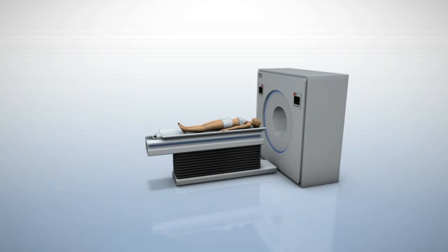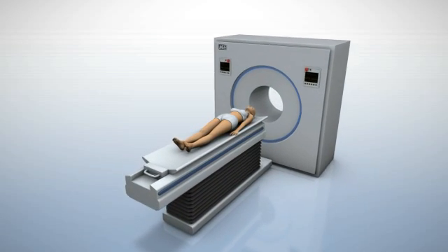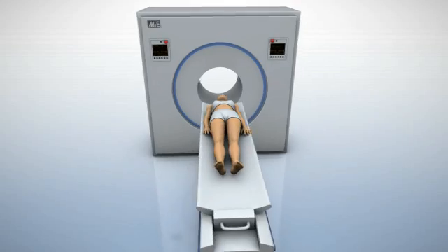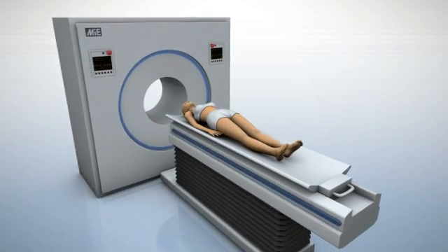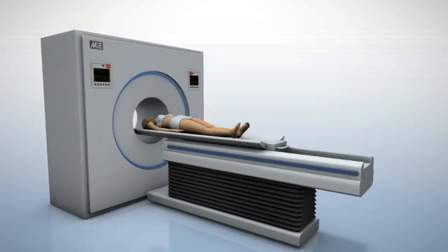The ECAT SYNTRON PET system from MIE provides the latest imaging techniques, extensive processing capabilities, and versatile image viewing tools, expanding the entire spectrum of examination options.